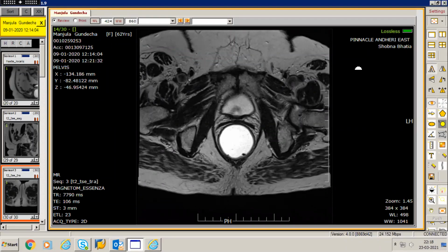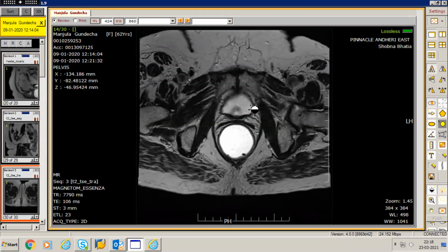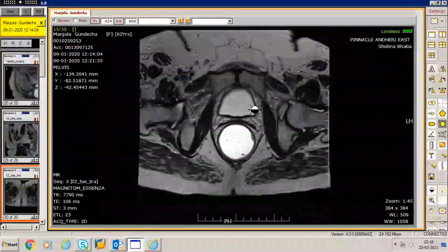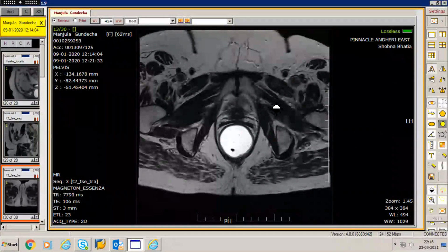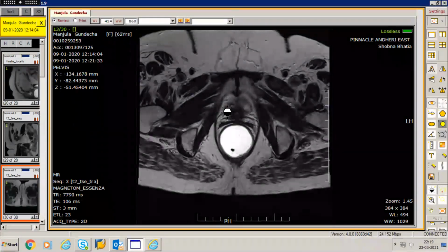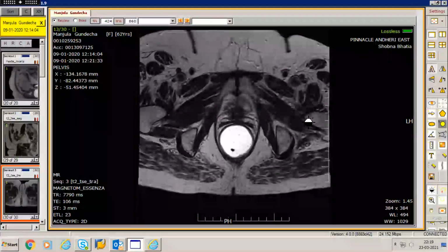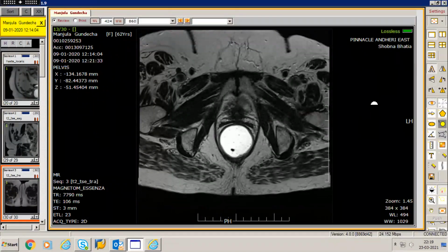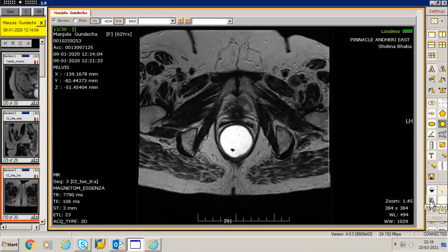So, guys, just want to reiterate. Can you just outline the posterolateral bladder wall, Swaroop? Now trace it, come down slice by slice, come lower down. So this supporting structure which you're seeing along the posterior bladder wall is the pubocervical fascia, which is a component of the endopelvic fascia. So now any damage to that fascial reflection is going to cause the posterior tenting of the bladder wall, allowing the prevesical retropubic fat to herniate backwards and then indent onto the vagina out here.